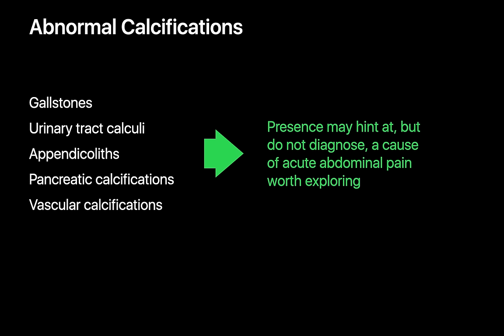Now let's review the top abnormal calcifications to be on the lookout for when interpreting an abdominal x-ray for acute abdominal pain. Objects like gallstones, urinary tract calculi, appendicoliths, pancreatic calcifications, and vascular calcifications are important to look for. They can sometimes hint at the cause of a patient's acute abdominal pain, though they can also end up being unrelated. When we spot them and haven't established an explanation for acute abdominal pain yet, their presence should prompt more investigation — often with a more diagnostic modality like ultrasound or CT.